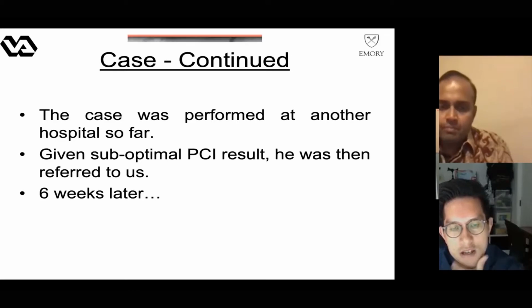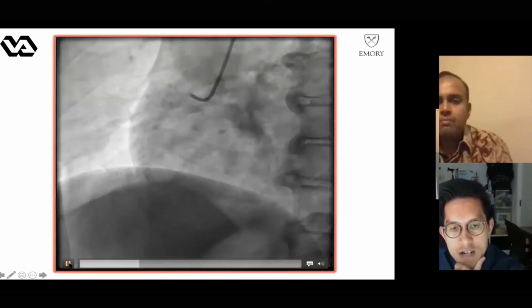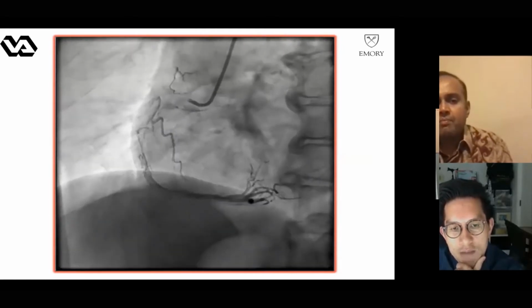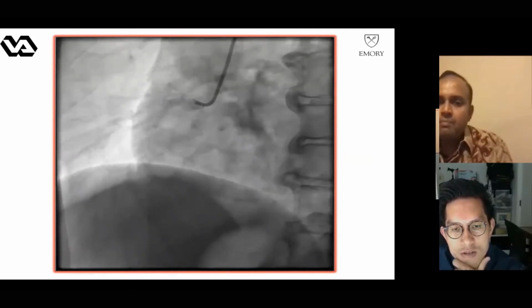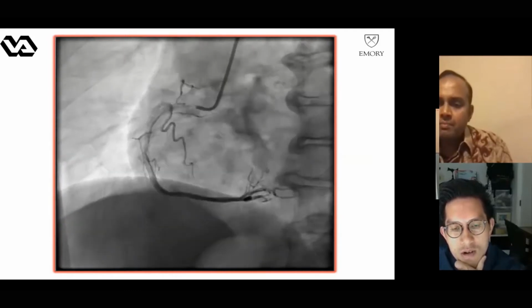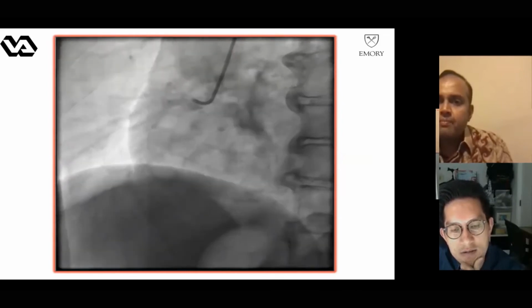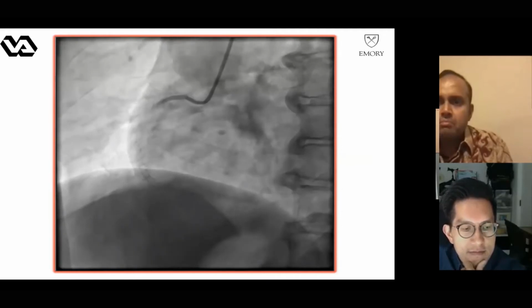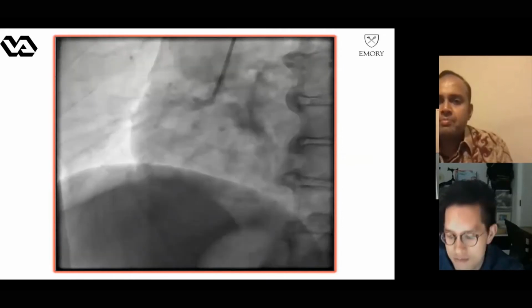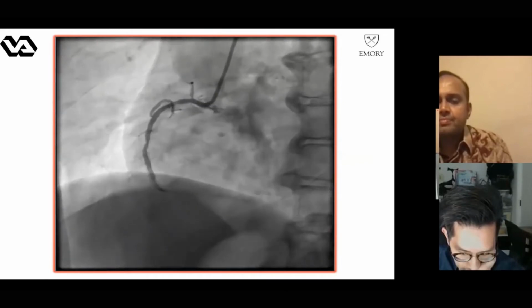So I know that the chance of ISR is high, but my impression is the flow is still okay. So I might wait until the patient has more symptoms, or do a re-angio maybe 3 to 6 months later. That's my feeling. Great, thank you, Vincent. So, Dr. Kim, what about in Korea? In this kind of situation, do you intervene faster, or will you delay?